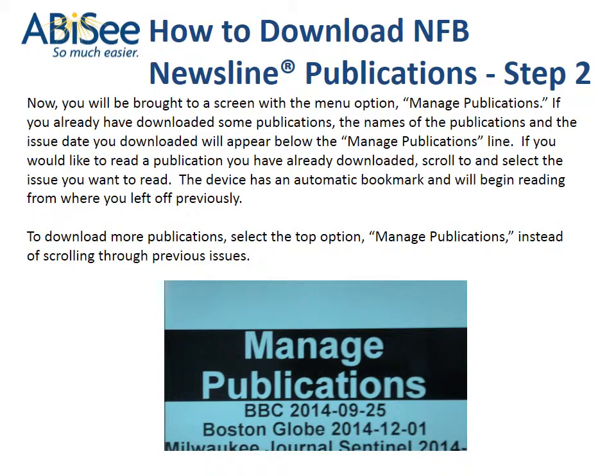Step 2. Now, you will be brought to a screen with the menu option, Manage Publications. If you already have downloaded some publications, the names of the publications and the issue date you downloaded will appear below the Manage Publications line. If you would like to read a publication you have already downloaded, scroll to and select the issue you want to read. The device has an automatic bookmark and will begin reading from where you left off previously. To download more publications, select the top option, Manage Publications, instead of scrolling through previous issues.